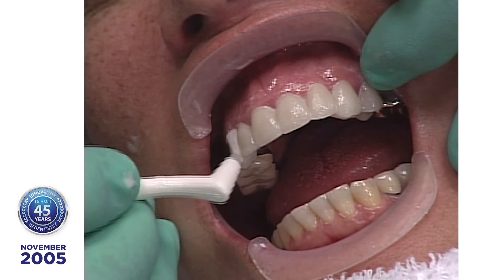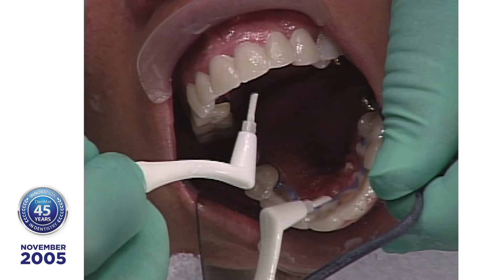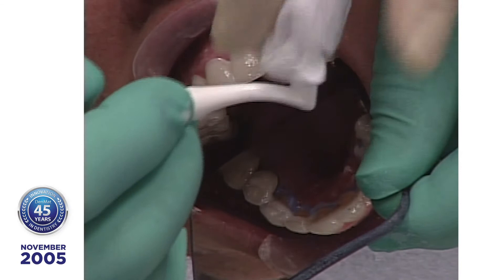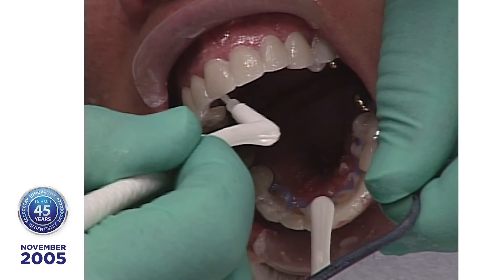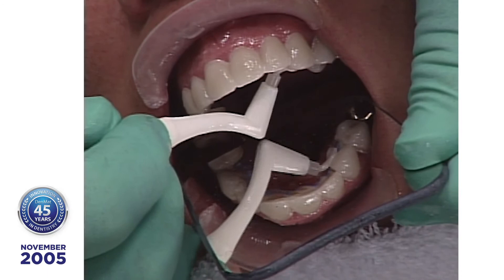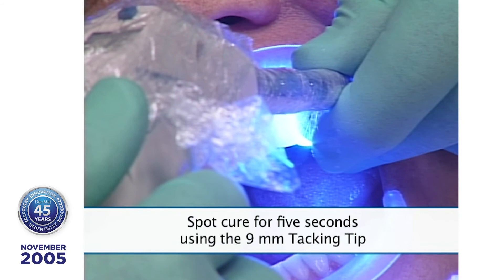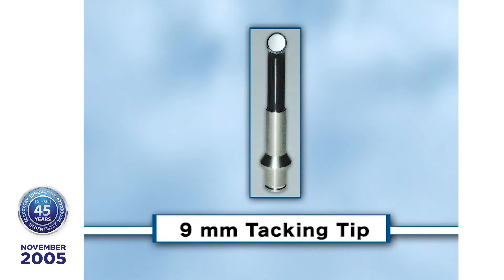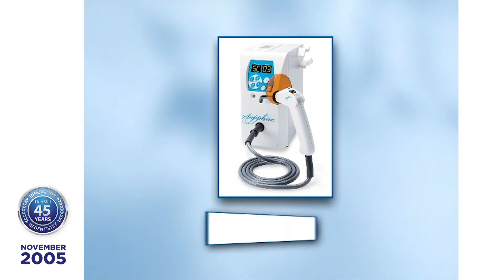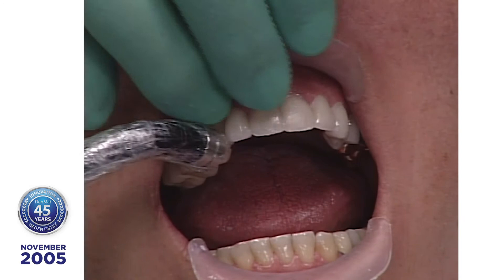We've got quite a bit in there so we'll start taking that out. I never floss between there right after placement because I've lodged veneers doing that — it's like the negative pressure you get when taking an impression and you get a void. Now we're going to do the real polymerization — we've got it spot cured in place. Five seconds per tooth, and we don't like more than a five-second exposure because it gets a little hot.